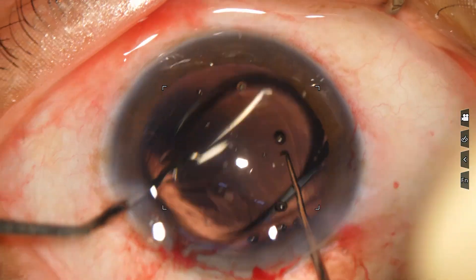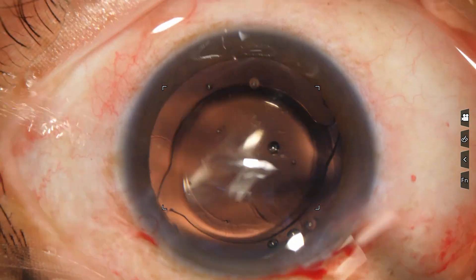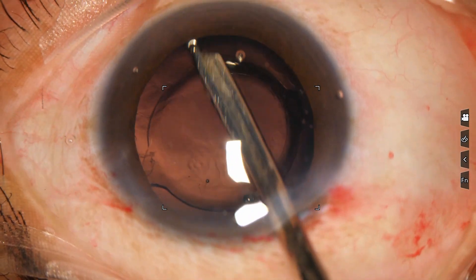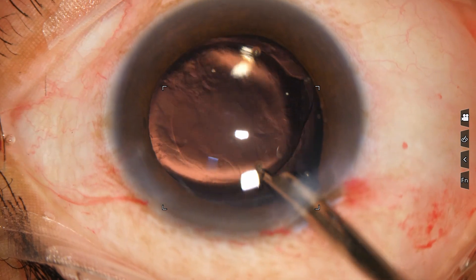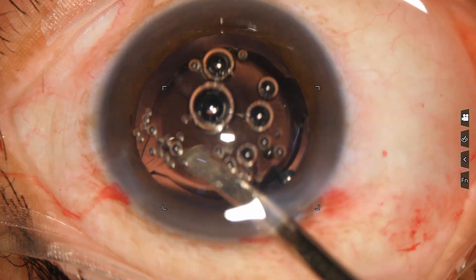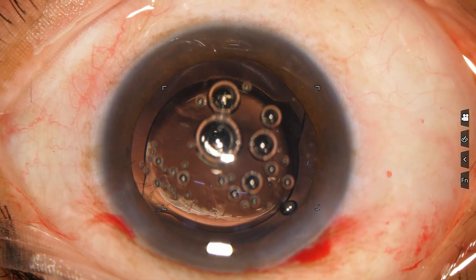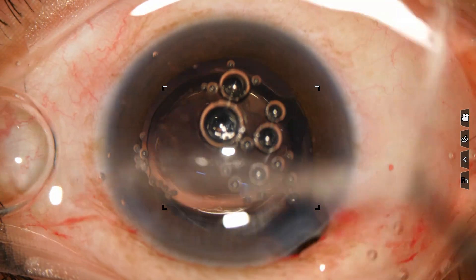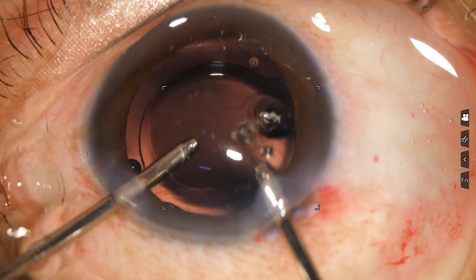There is a lot of viscoelastic in the anterior chamber and the capsular bag. First I irrigate with a Simcoe cannula to irrigate the capsular bag, then I aspirate a bit. Some air bubbles have gone into the anterior chamber. Now I am going to use bimanual irrigation-aspiration cannulae. The irrigating probe goes first, and then irrigation-aspiration is used together.